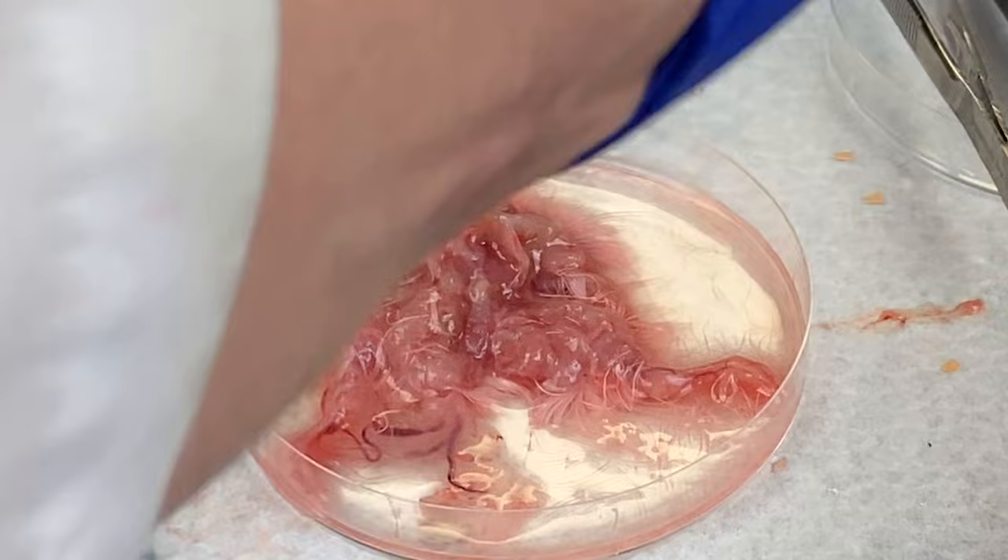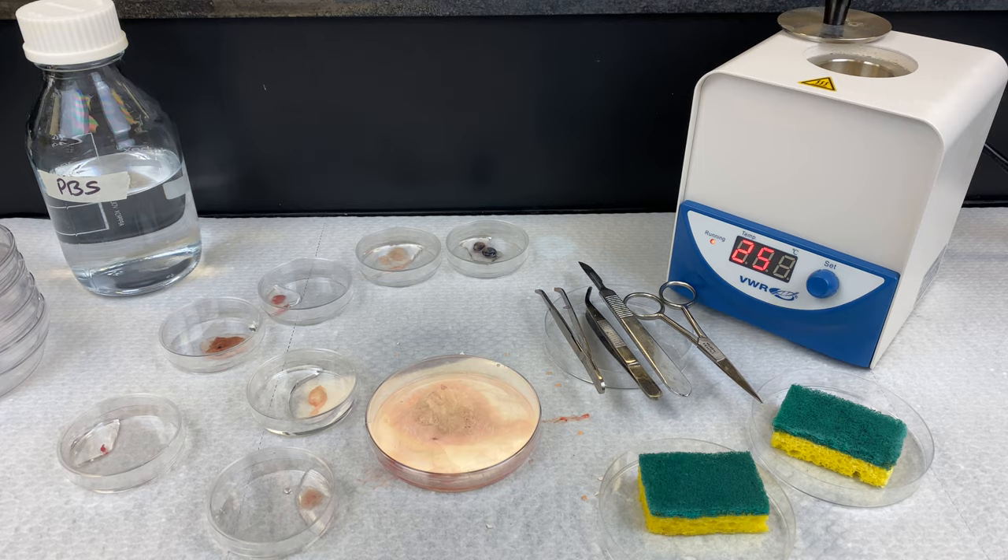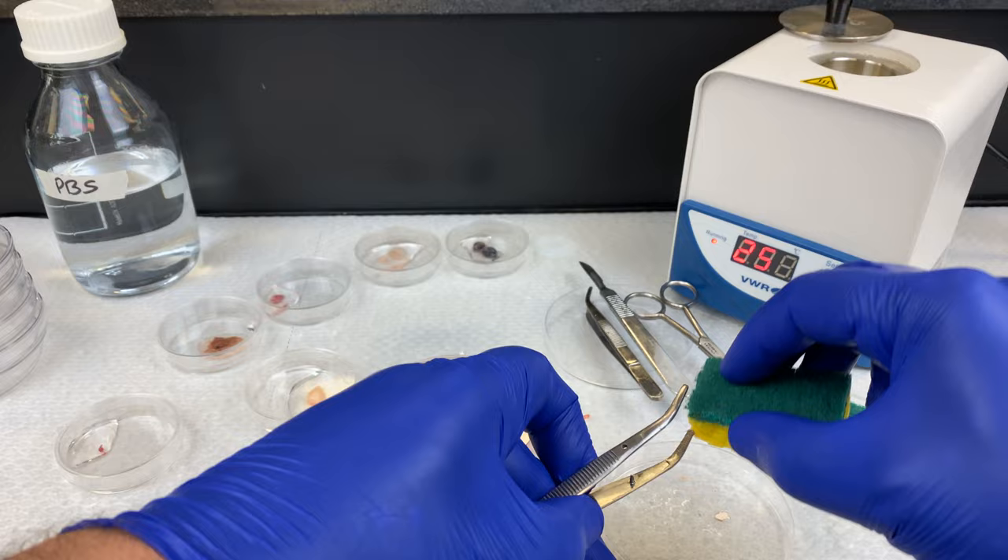If you look at this embryo now, it is just a mess, but I've taken out all the organs I'm going to. Try and plan your dissection. If you just start cutting any which way you like, in the end you'll just have a pile of chicken goo and there won't be any solid organs to obtain.